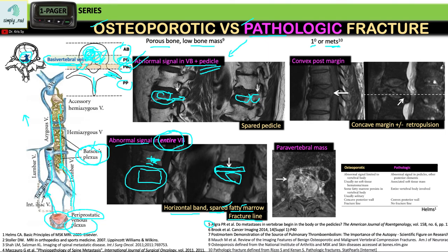Next, we also have a sign of the convex posterior margin, which is a sign of pathologic fracture. It also makes sense because when you have red marrow in the vertebral body and you have a lot of neoplastic cells there, you're going to have bony expansion.